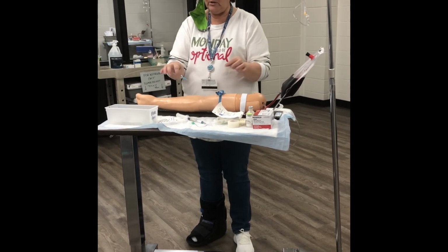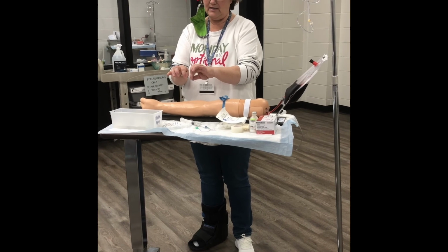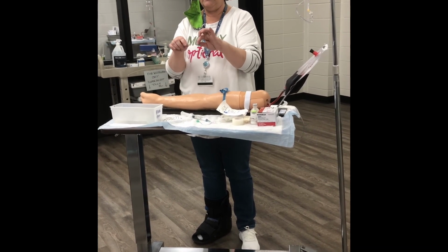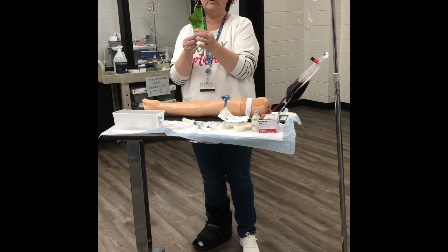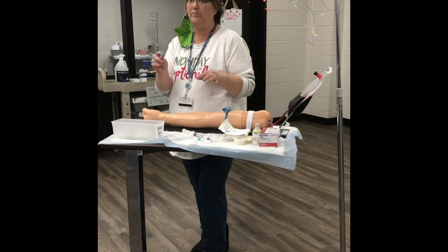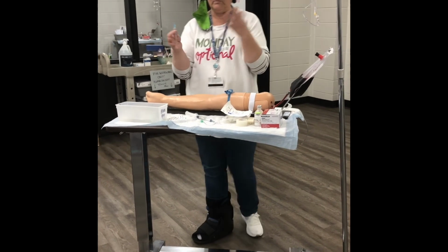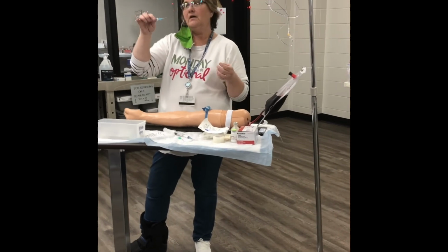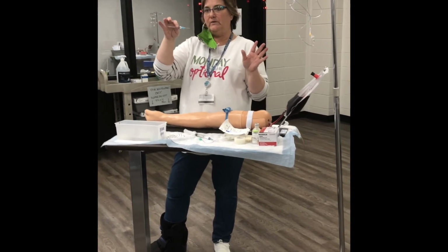But when you're practicing, you can stick and take this colored part and slide it down and just set this to the side, and then you can just put it back on and reuse it. All right, in your competency, and I'm going to do it, you'll push the button, because you want it to retract and be safe. Okay, we're going to stick it at about a 20-25 degree angle.